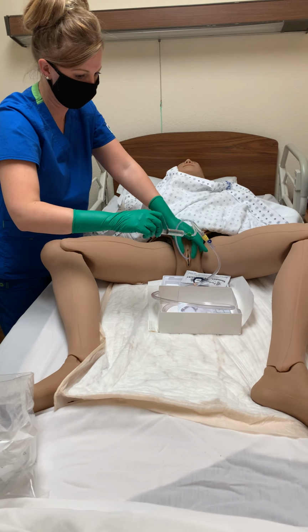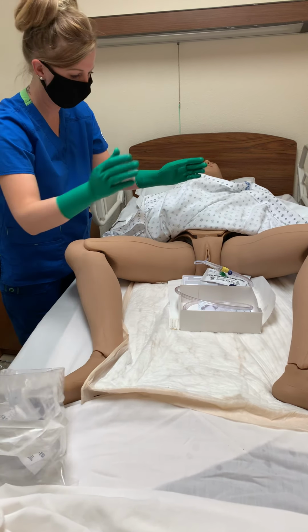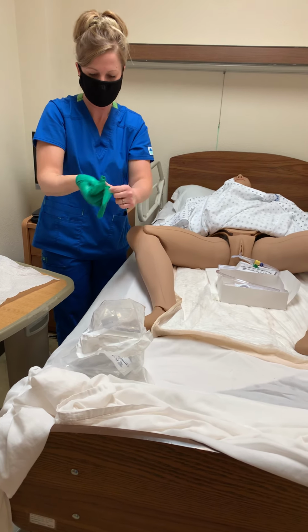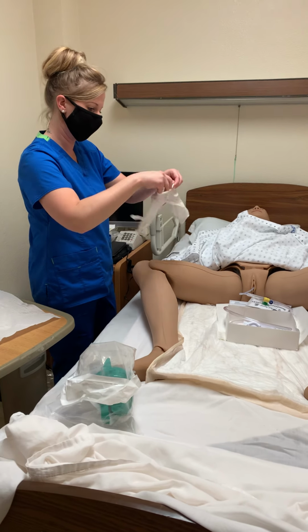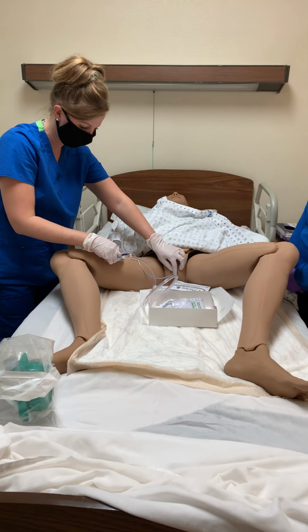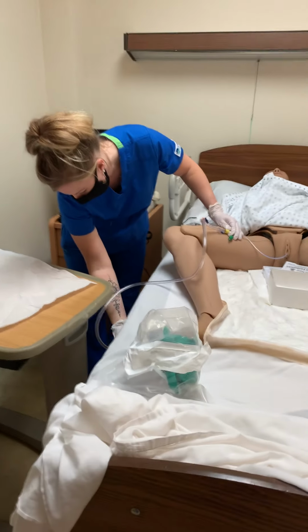Okay. We have her set, Joanne. We're going to take this off. And then with our 5 milliliters of water, as it is in, it's no longer a sterile field. So I can take these gloves off. I am going to put different gloves on. After this, I would get a leg strap, have it connected to Joanne, leave a little bit of room there. I would package all this up, throw it away. I would have this hanging at the end of the bed. There.